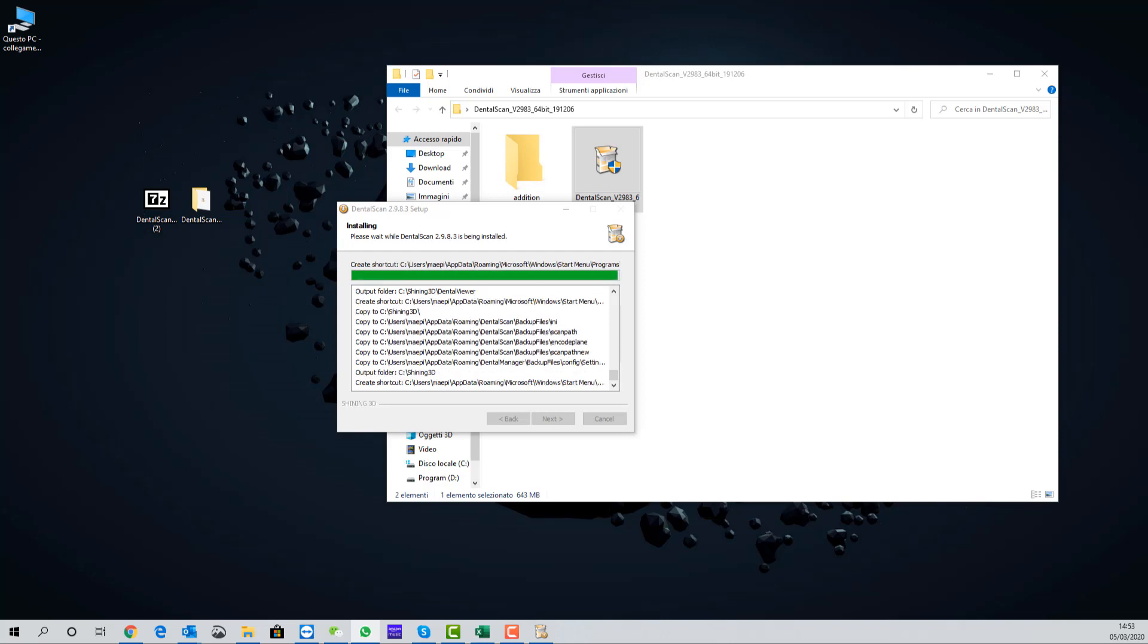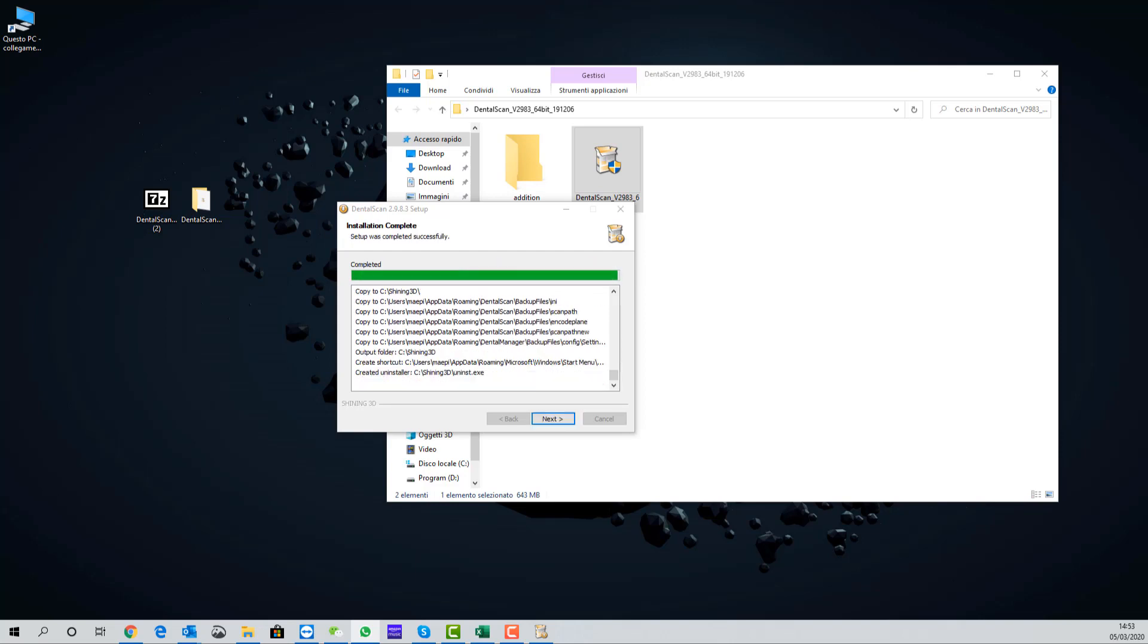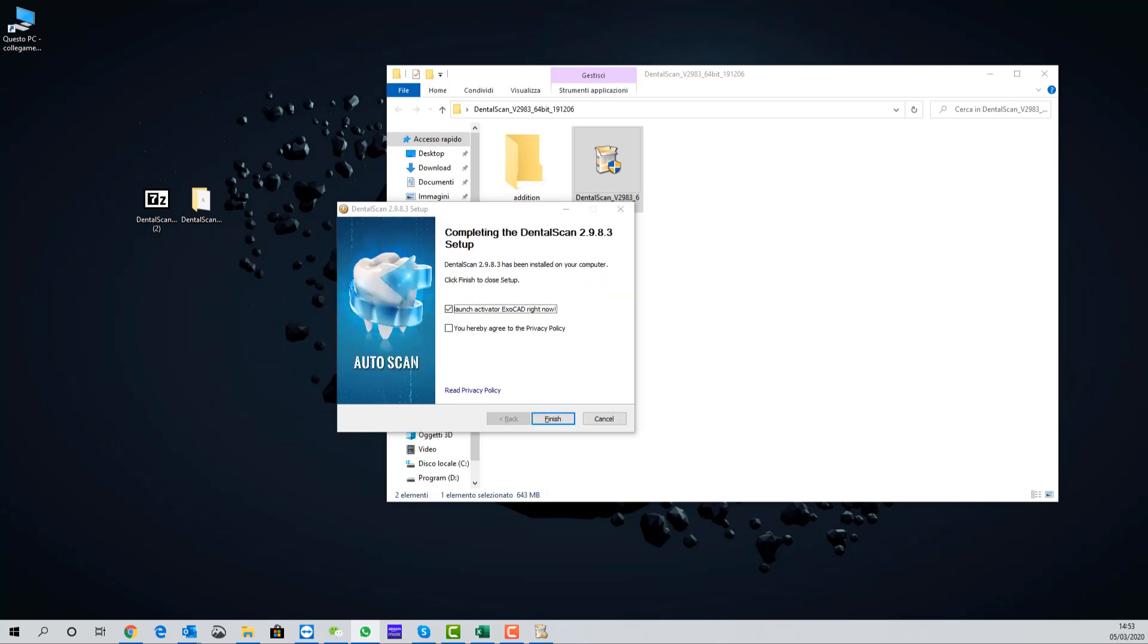At the end of the installation process, it's necessary to flag the policy privacy and if you have Exocad, it's necessary also to flag the Exocad integration.